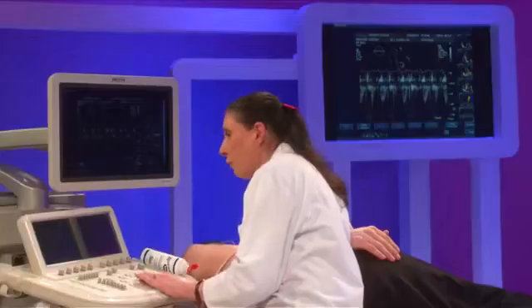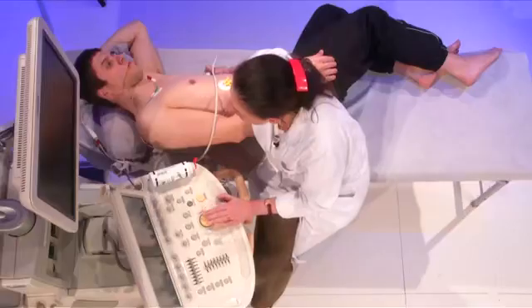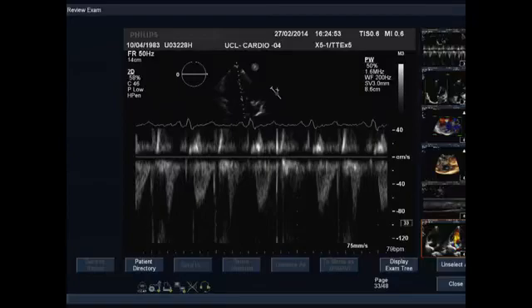One other question that you may ask is what are the repercussions of the atrial septal defect, and for that it may be useful to go to the apical four-chamber where I'm still present, and to make the measurement of the flow through the tricuspid valve.